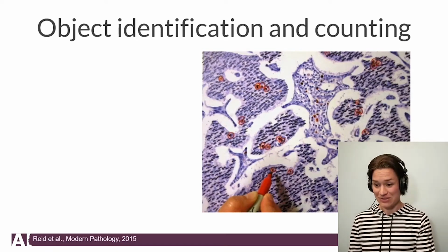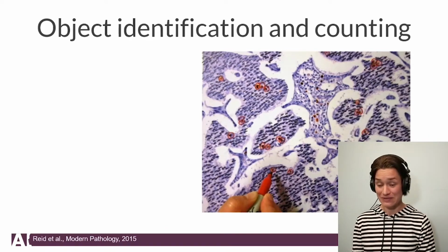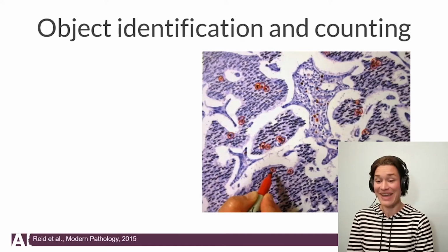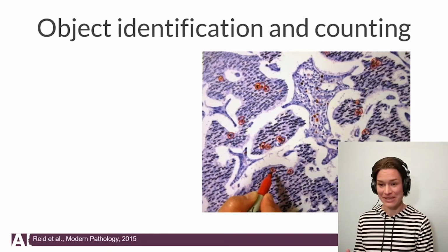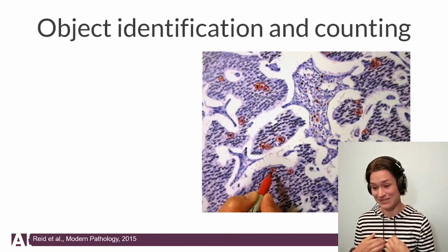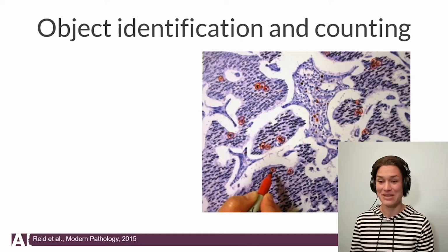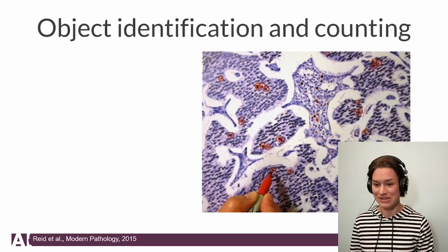And I love this picture. It's from Modern Pathology in 2015. This was the official recommendation on how to count Ki-67 positive cells for breast cancer diagnosis. You were supposed to take a picture of an image, print it out, take a pen and mark in red the Ki-67 positive and mark in blue the non-positive, obviously only epithelial tumor cells. I love it. It's already ancient, 2015, because the field has developed so much and we have many algorithms that are approved for that. Not deep learning, just classical machine learning, but I love it.